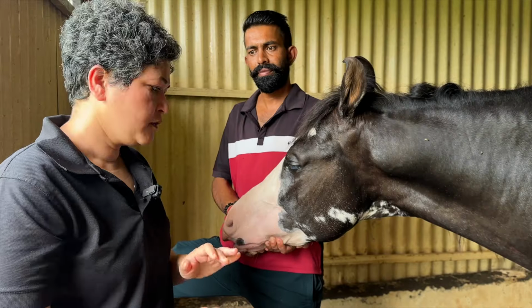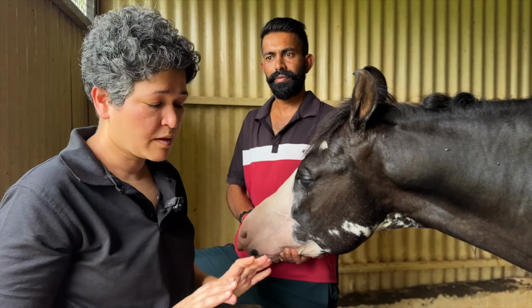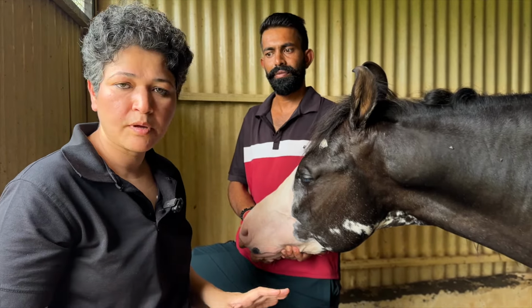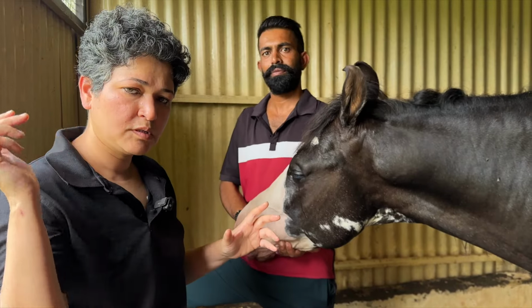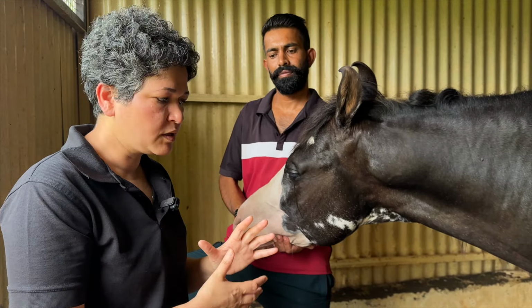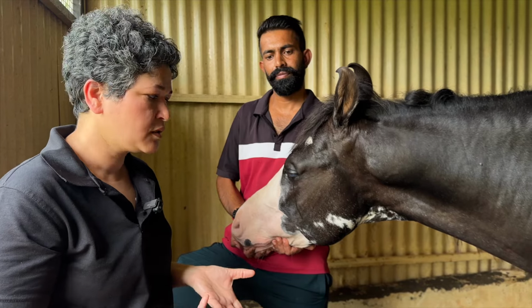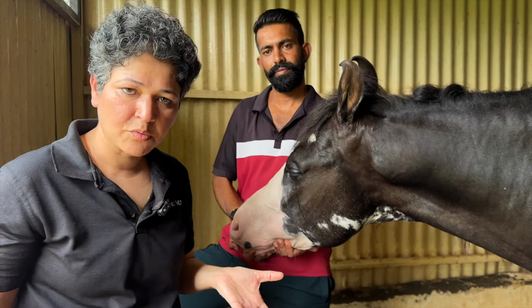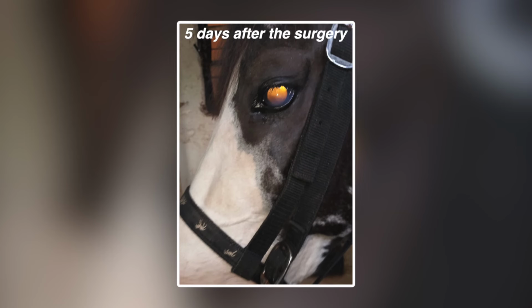Be aware. If anybody is telling you, let's give medications and kill this worm, that's wrong. That's absolutely wrong. That worm needs to come out with surgery. Another important thing, this is for the vets: if you take an incision and you squeeze the eyeball, that leads to destruction of the eye. The eye is a very fragile structure, so the worm has to gently come out. This is the best way that you can actually take the worm out.